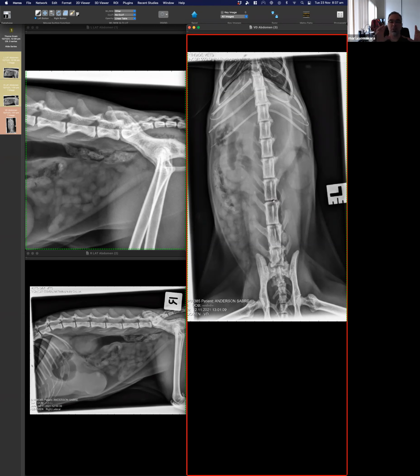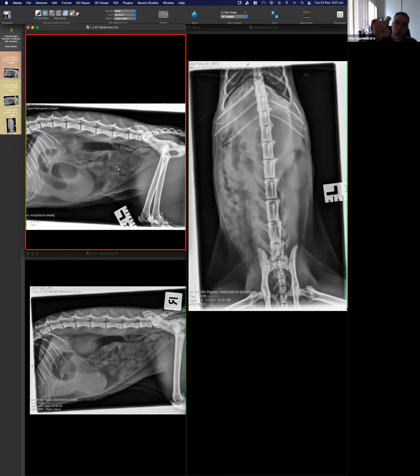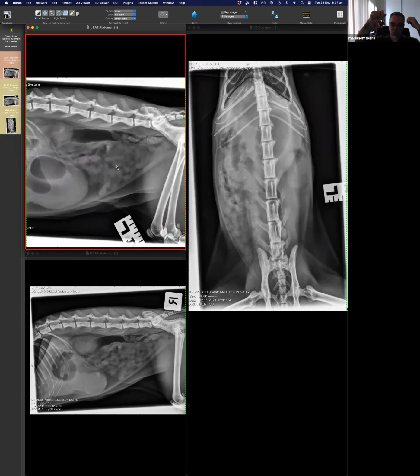Usually that assessment, I need to double check, but I'm pretty sure I'm right, is in association with having a fat cat. This is an exception to the rule in that sense. But yeah, that's the point. If you want to go further and you don't like that explanation, then I think you need to go back to the principles. Is that small bowel enlarged? Is the content abnormal? Makes sense?